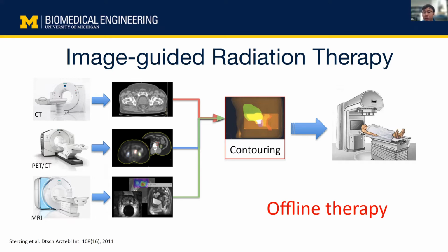But it's also very challenging because if you deliver it as it is, there's no real-time feedback for the radiation dose delivered. So the total therapy is an offline therapy. Currently, it's still very challenging to monitor the radiation dose online so that we can optimize the treatment planning, which is also a very hot topic currently, named adaptive radiation therapy.